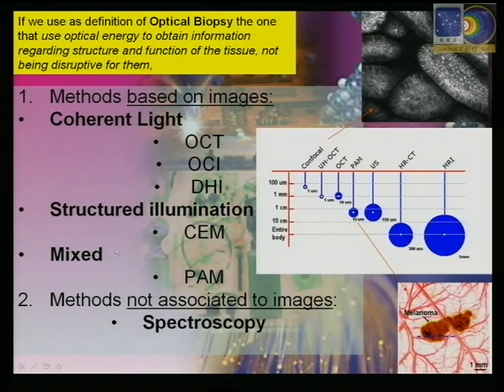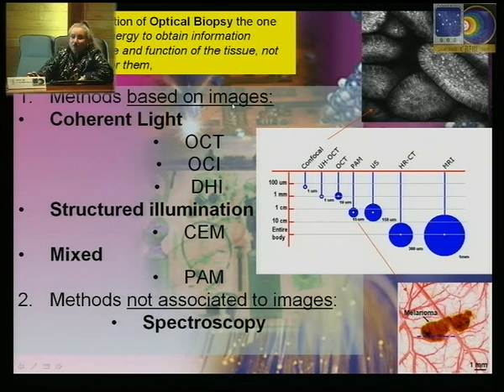What is interesting is that now methods that allow us to see the tissue allow us to make the diagnosis. That means they allow us to make the biopsy and the diagnostic procedures on images that look like the ones we have in the microscope.